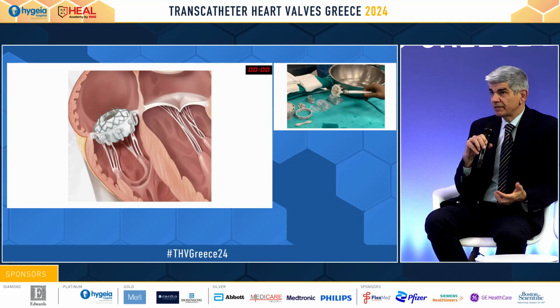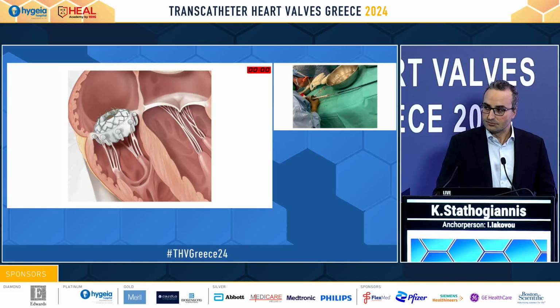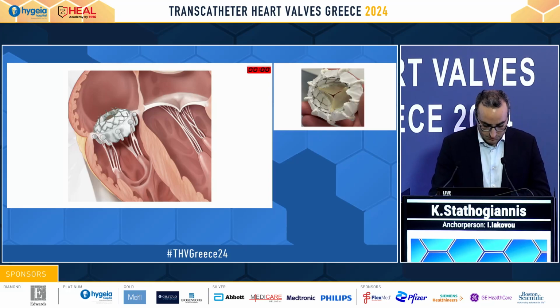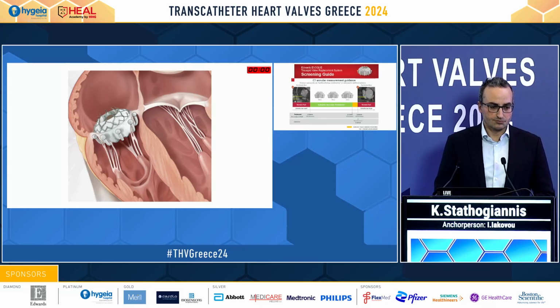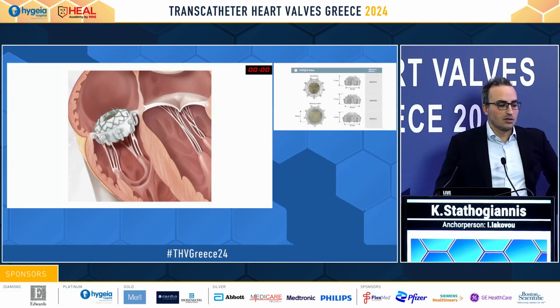So, stable medical management. I can add that she's doing well and certainly improved after this procedure, compared to the improvements she had after the TAVI procedure. So she needs less diuretics, I suppose? Yes, her symptoms have improved considerably. I would say that she's now happy with her daily activities and can do things that she couldn't do before. She's coming for the 1 month follow-up in the next few days. So it's too early, but the first messages we get from all these first patients are very encouraging.